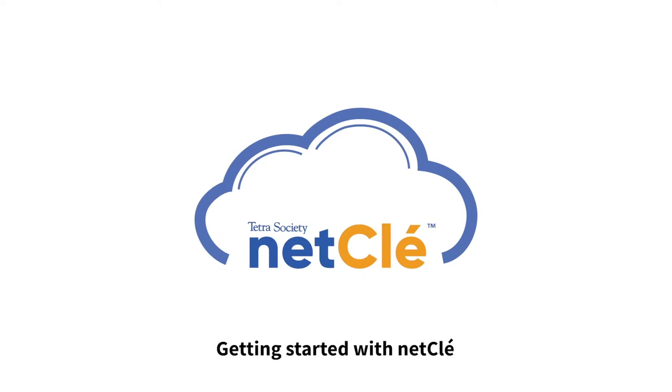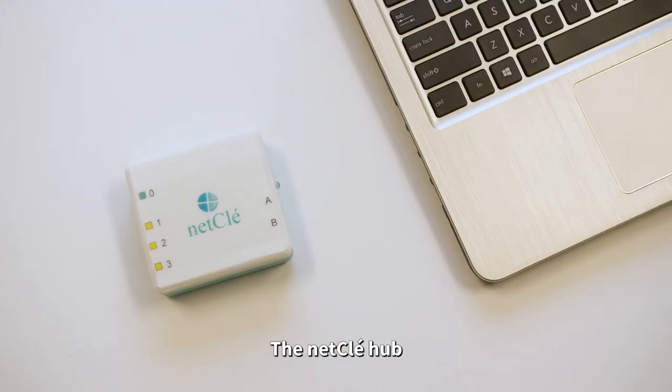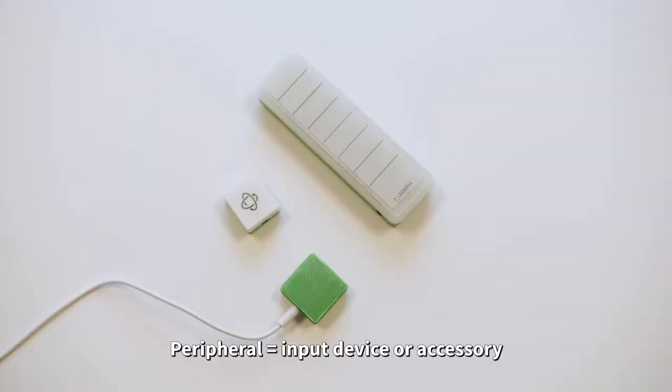netClé needs a few things to work. Let's go over the basic components. You need a computer, the netClé hub, at least one peripheral, and the appropriate software.